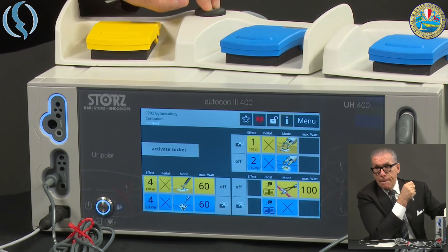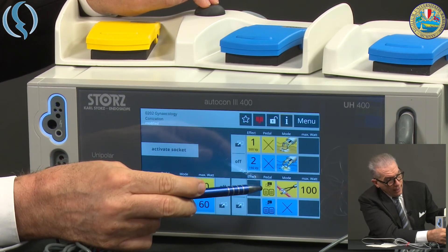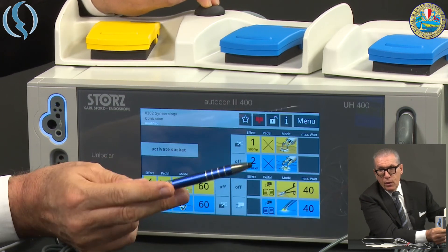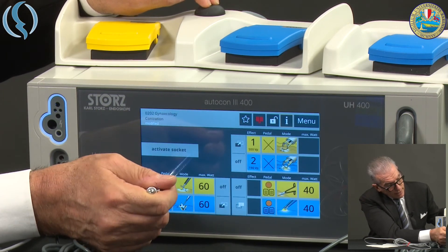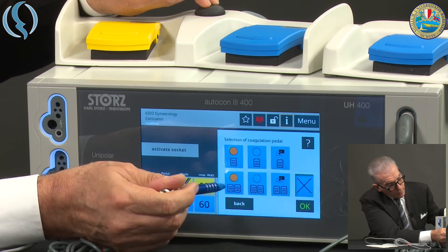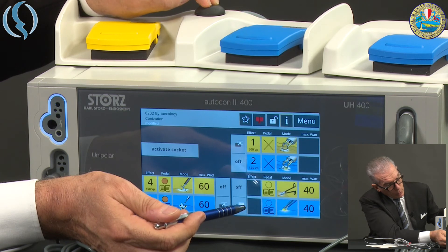Because I have assigned a different pedal to this socket, if I want to go back to switching between bipolar and unipolar, I only have to choose my original mode and assign it to a different pedal — this one — and reassign the unipolar to the non-highlighted one. Now I can switch between bipolar and unipolar and back to bipolar.